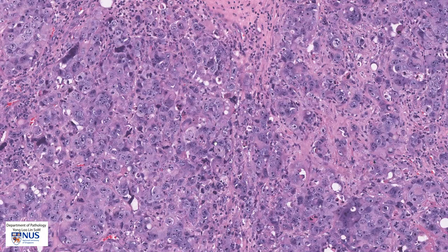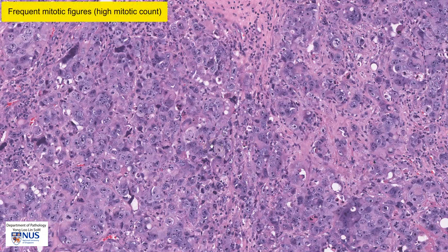In this field, we can see plentiful mitotic figures. For example, there's one here, there's one here right beside it, another one here, here, and here again. There are numerous mitotic figures in this tumour, and this is a sign that this is likely to be a high-grade tumour.